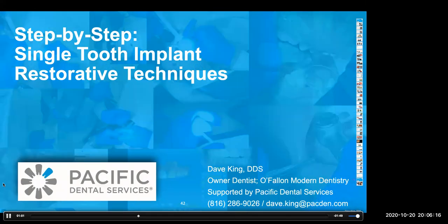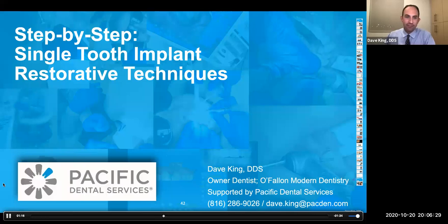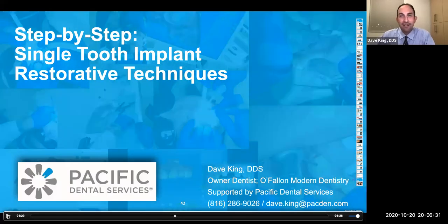And what traditional final impression material do you use typically? PVS or polyether? PVS, yep, or VPS, depending on if you're a purist or not. Yeah, so I don't normally use polyether. I don't think I've used that in a long time, although I've heard good things about it. I usually use PVS if we're gonna use it, but most of the time we're scanning.